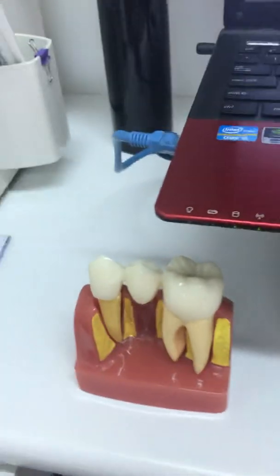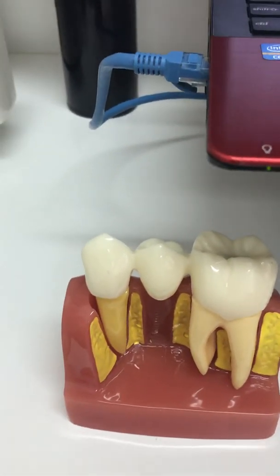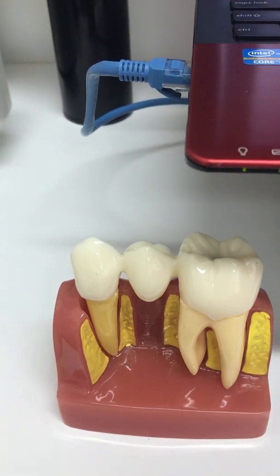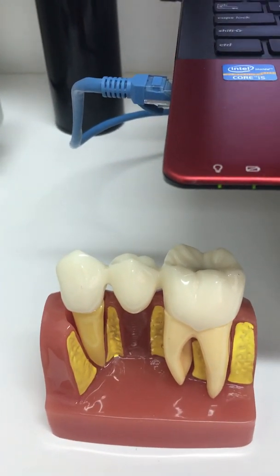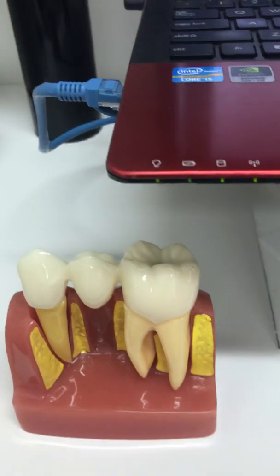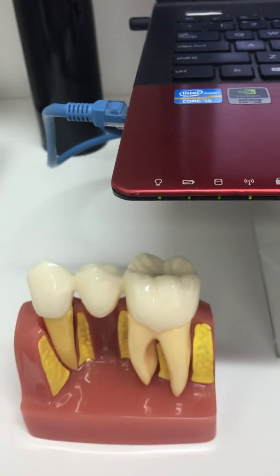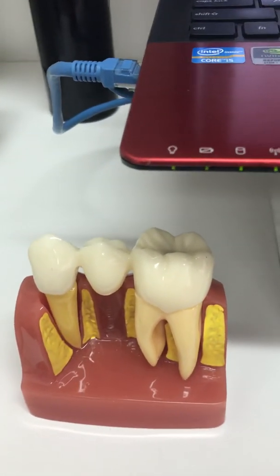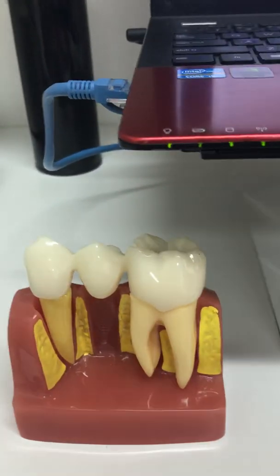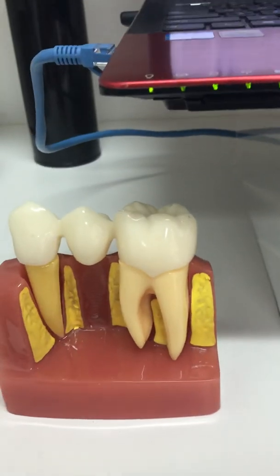The other type that looks sort of white but not exactly white is what we call a full contour zirconia crown. To know which one is which, you generally have to ask your dentist or refer to the lab sheet in order to find out.